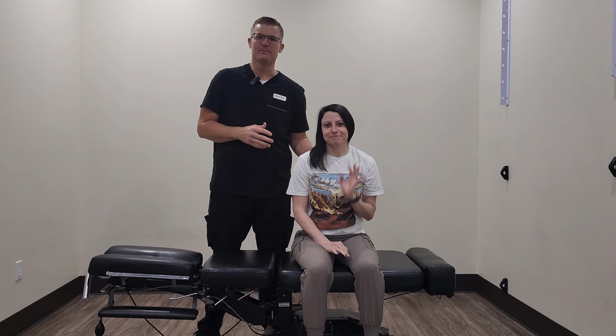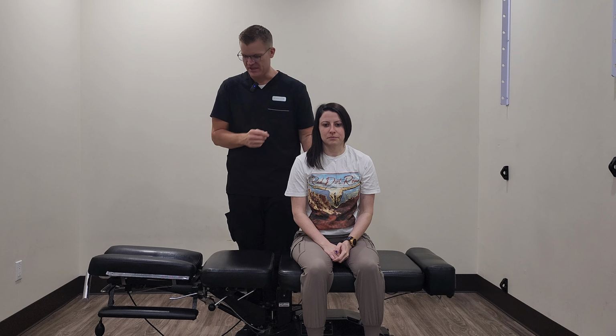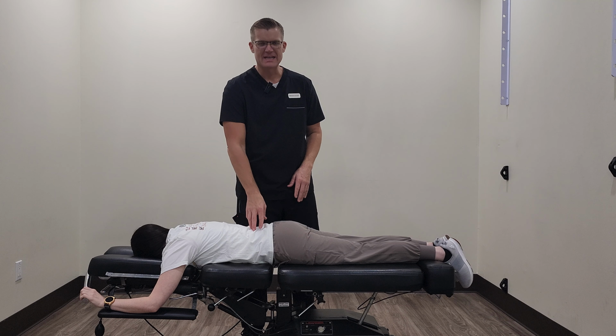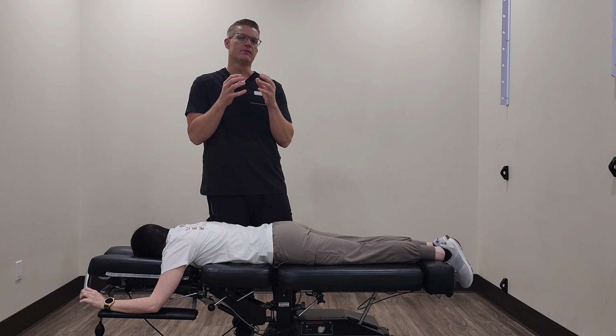I have Chelsea here to help demonstrate the flexion distraction technique. So Chelsea, we're going to start by having you lie down on your stomach for me. Now Chelsea has some complaints in her lumbar spine, and we've worked with her before. She also has a little bit of a disc injury going on. So flexion distraction technique is a great therapy.